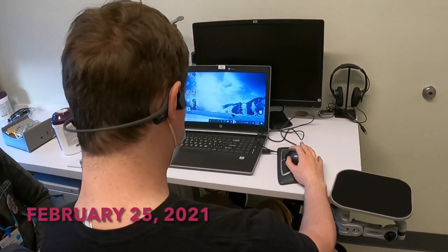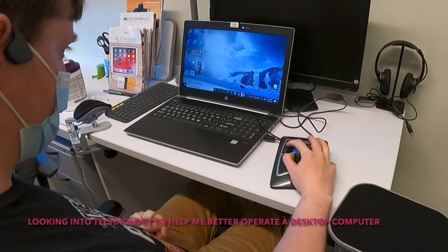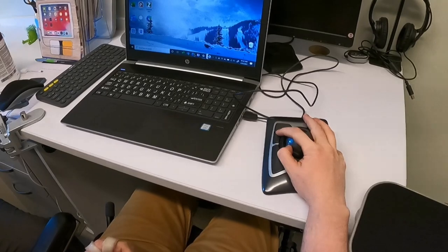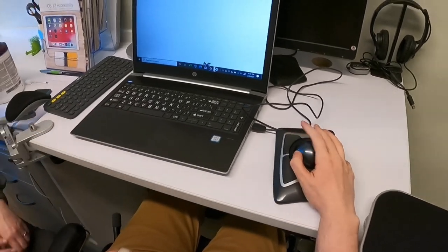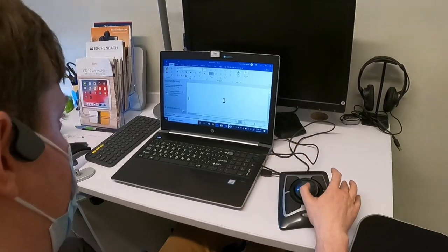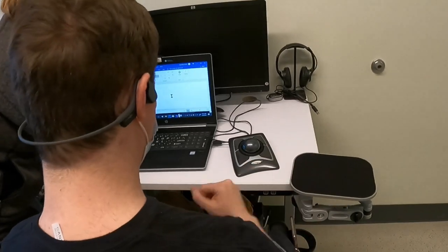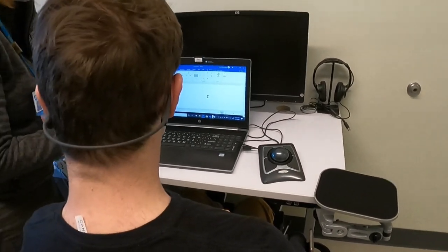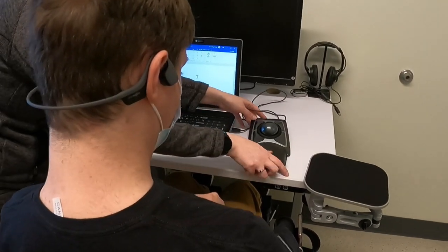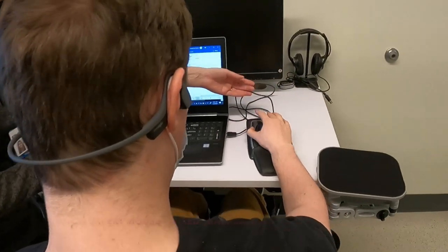If this seems too fast for you to have good control, or it's hard for you to keep your hand up, maybe the wrist rest would help you. You could get a little bit more height.